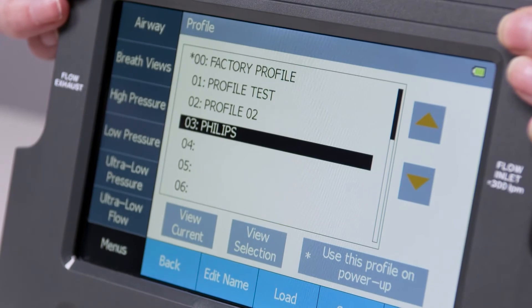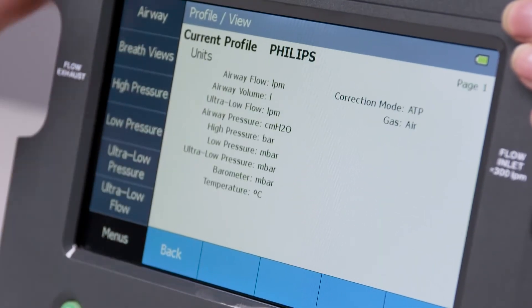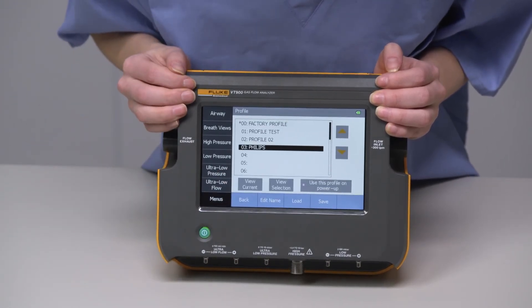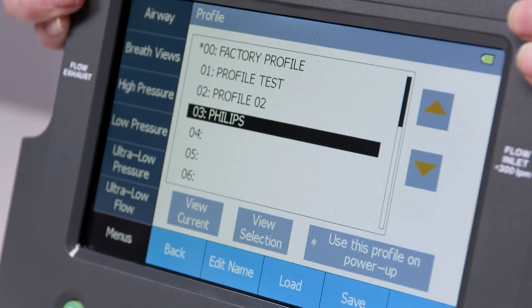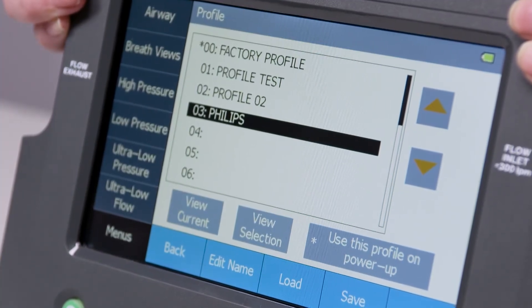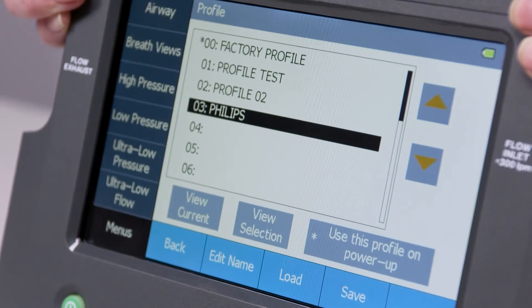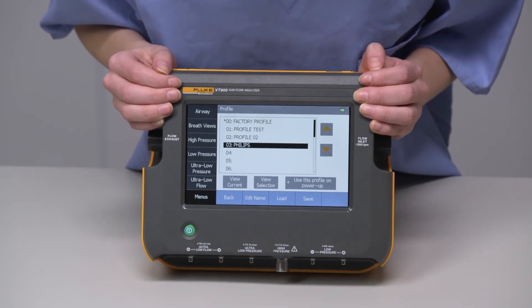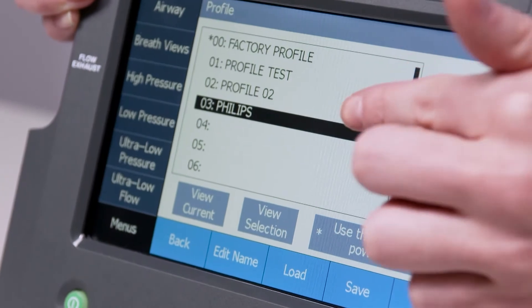We can look at the changes we've made and our current setup by pressing View Current. Let's go back and save this as a profile. In the future, when we have to use this same setup or test this certain ventilator or other gas flow device, we don't have to redo our test setup. We're going to select which number we want to save it as. Let's say we want this to be the third profile. We highlight the third profile and hit Save.